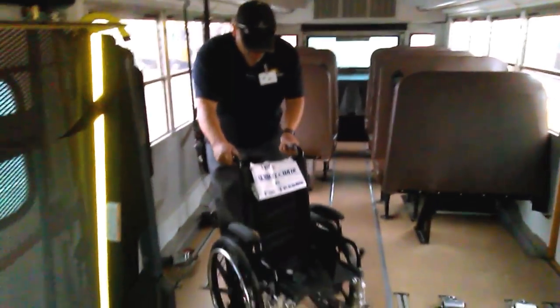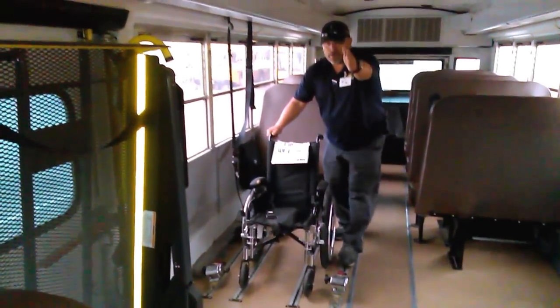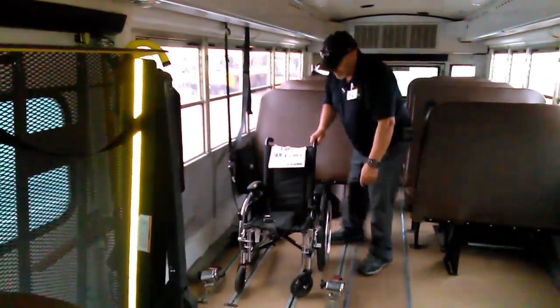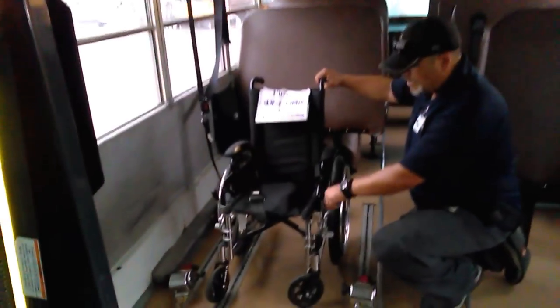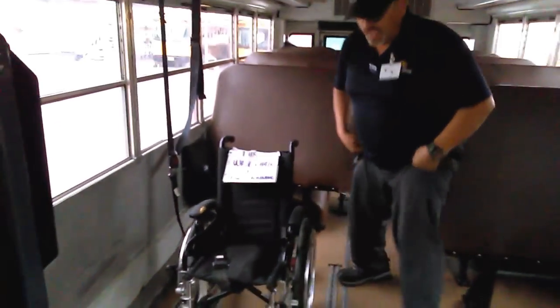So I have my wheelchair here. The student is always going to be facing forward — facing you, the driver. You secure the chair at the center, and you want to first secure the chair using its own braking mechanism.